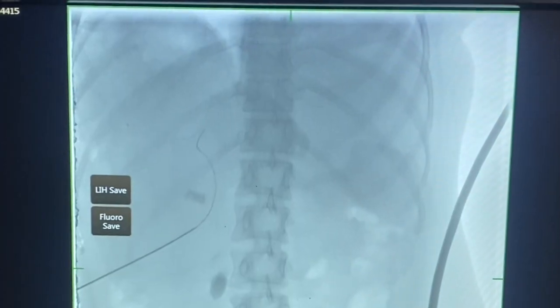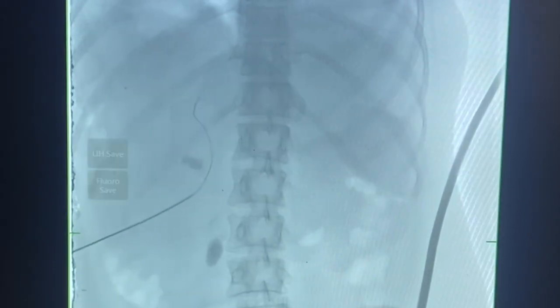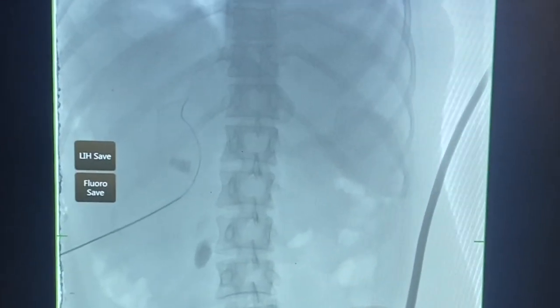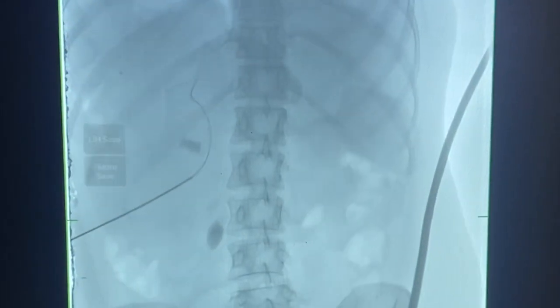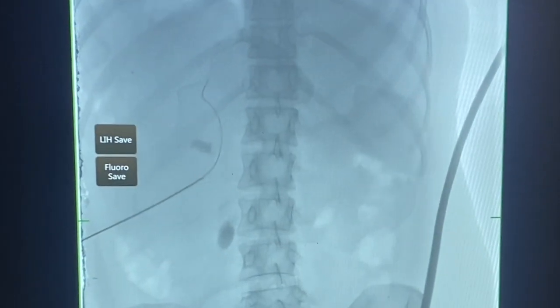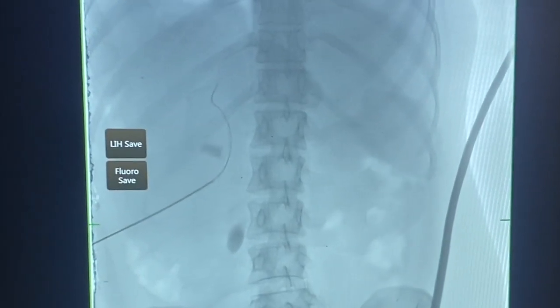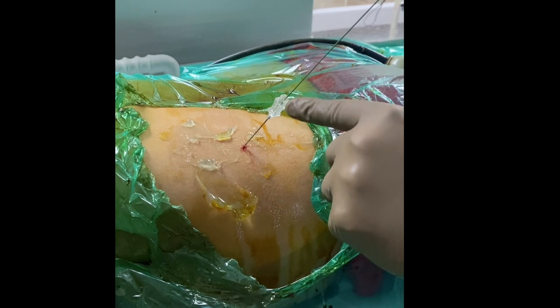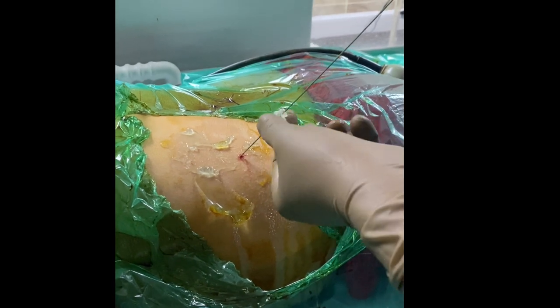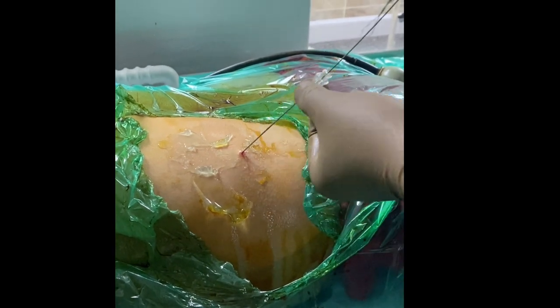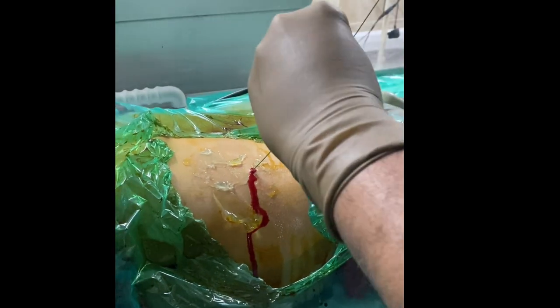Once the guide wire has entered the system, fluoroscopy is used to reconfirm its position. You can see two stones — one in the kidney and one in the upper ureter. After the guide wire is confirmed in place, the needle is removed.